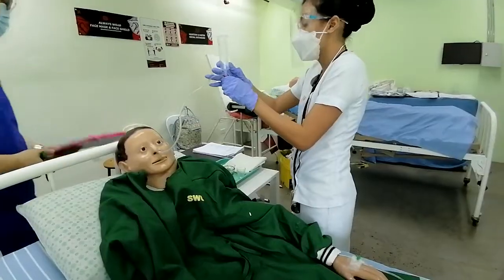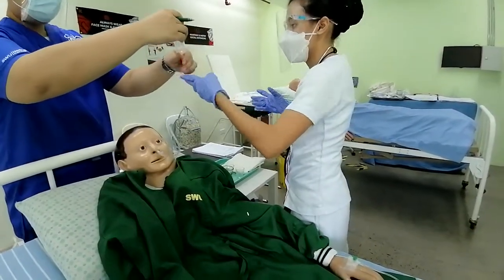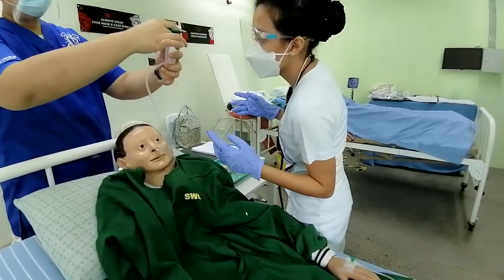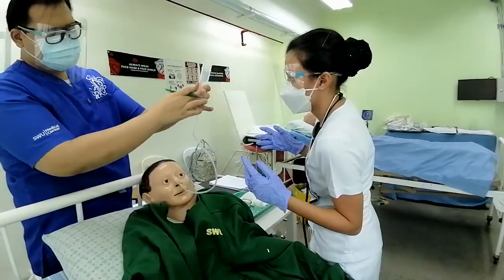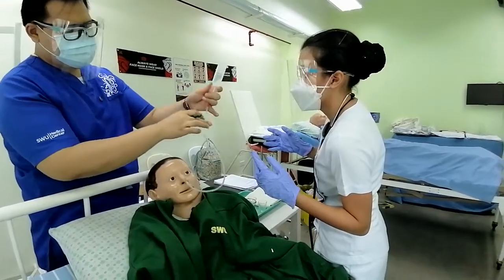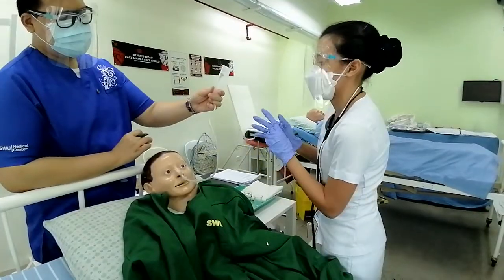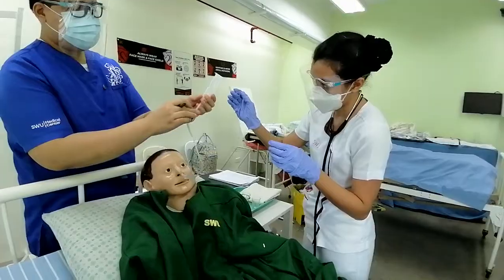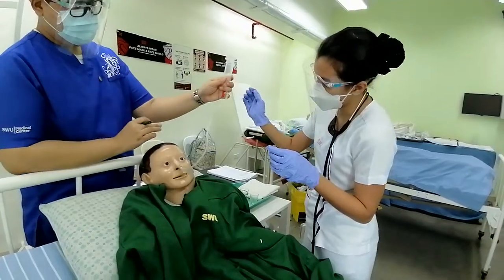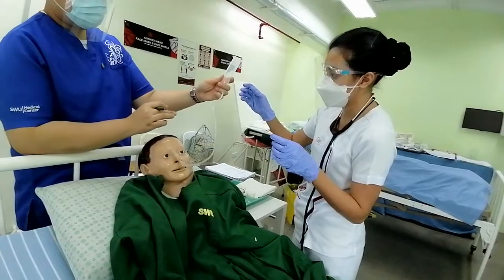I want you to do this technique. That's okay since you hold this part, but you do it this way. Hold it with your three fingers and your thumb. This one is the one that you're going to do the kinking. So you will now try it once. So it takes mastering.